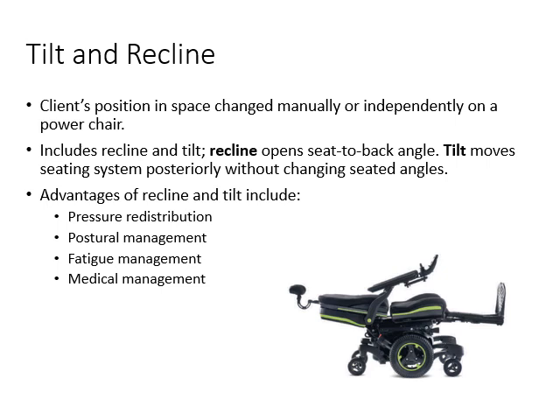There's many advantages to a tilt and recline. It helps, of course, with pressure redistribution. It helps with getting back into alignment. It helps with posture. Helps with fatigue if you want to just lean back and rest a little bit. Helps to get your heart rate settled. Just being in a reclined position, almost like a supine position, helps in many different ways. And so tilt and recline is often a feature that we have to justify medical necessity for, but we can talk about that later.